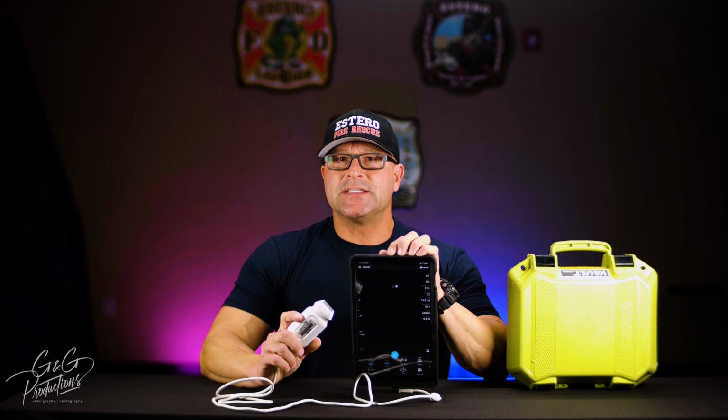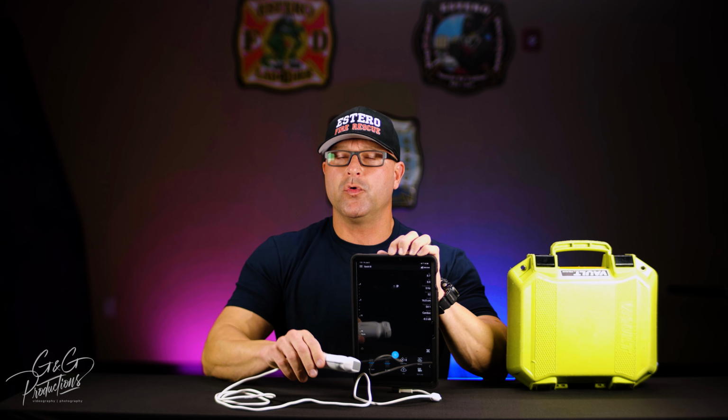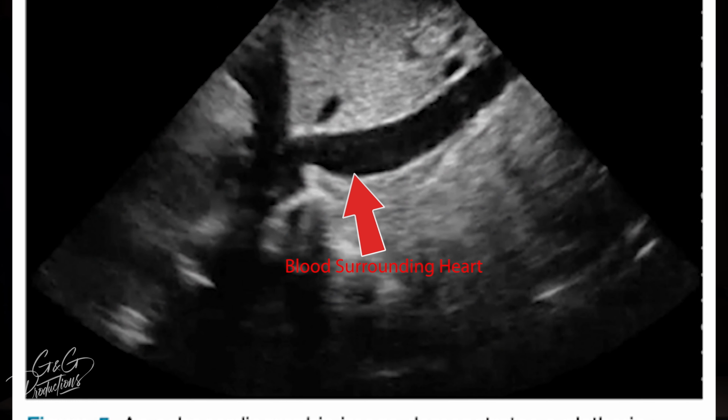Any fluid or blood that you see has no echogenicity, so that would be anechoic, right? It means it gives no color. Because the sound goes right through that blood, you would see the blood in the image as being dark or having nothing there, just an empty space, right? In the presence of blood.